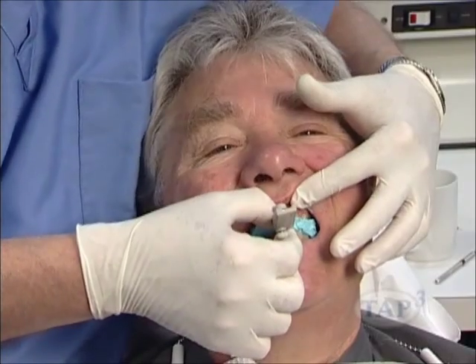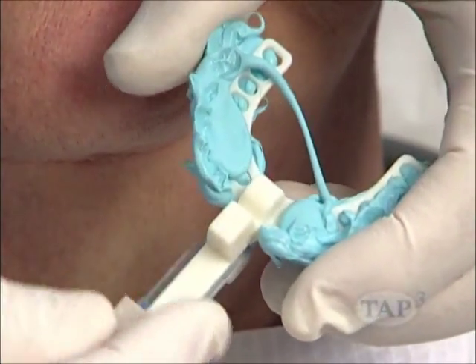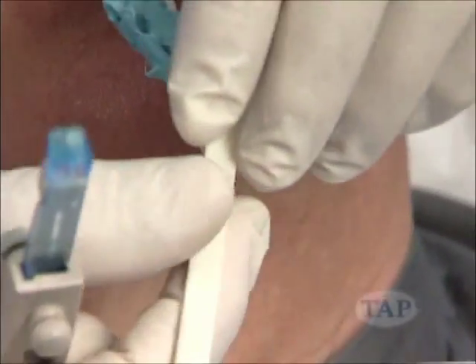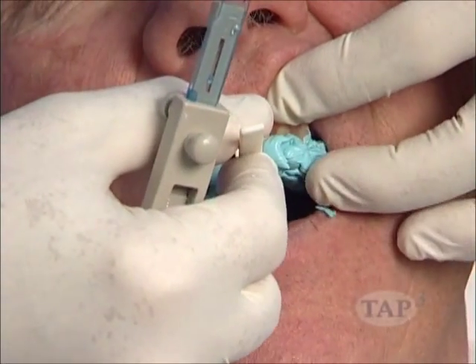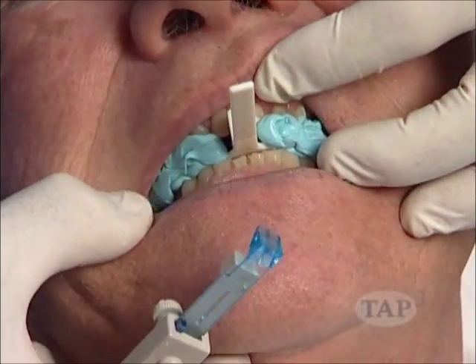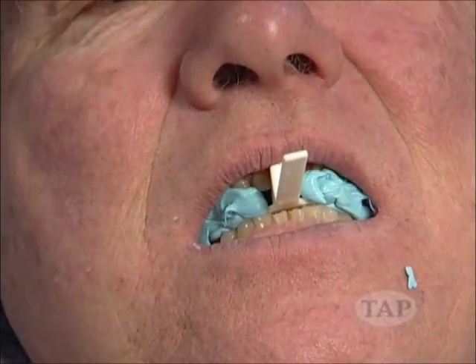Remove the bite fork from the patient's mouth and remove the fork from the George gauge. Place the bite registration back in the patient's mouth to check for fit. Start the process over if you did not achieve a quality bite.